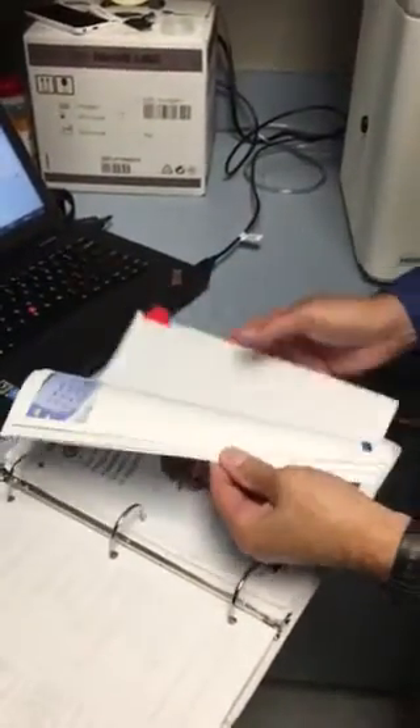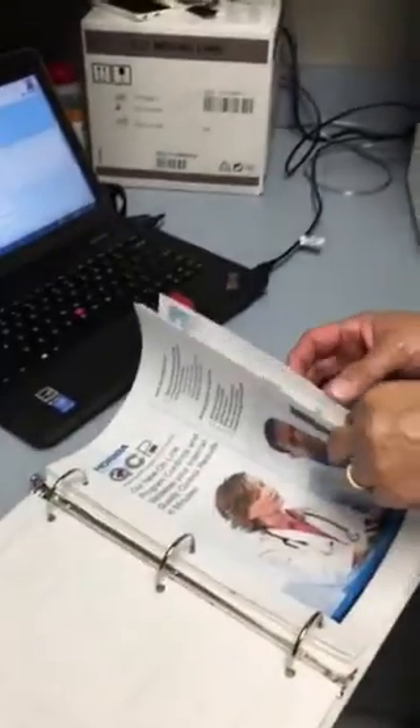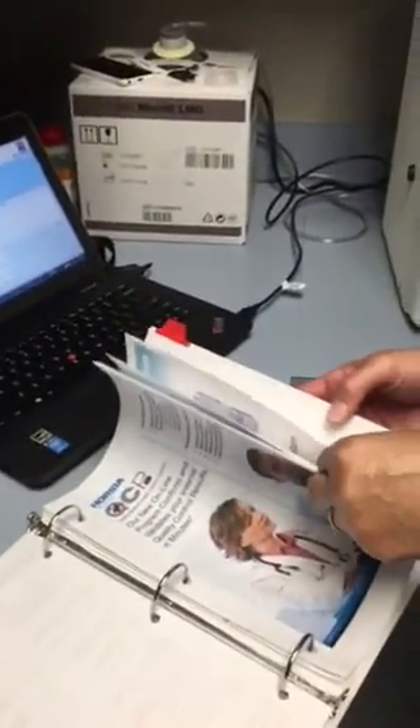This binder is like a good training manual — step-by-step. But this is an older one. Do you have the new one with you? Could you grab it?